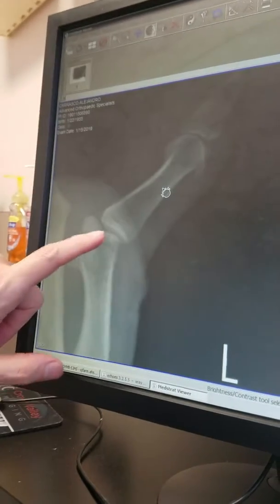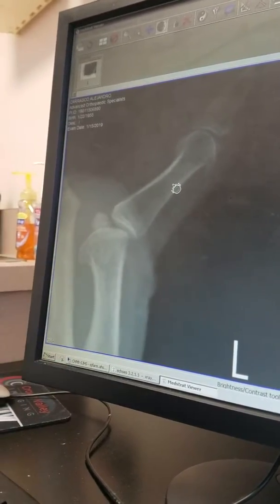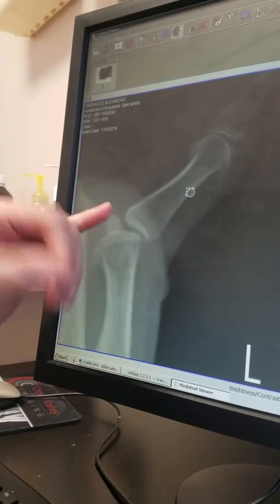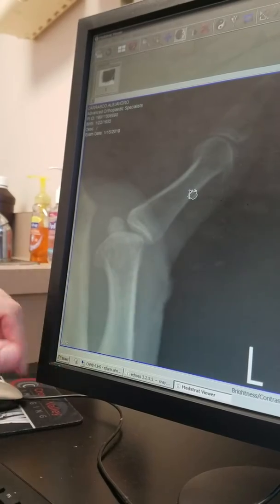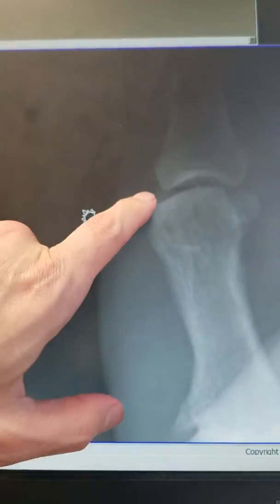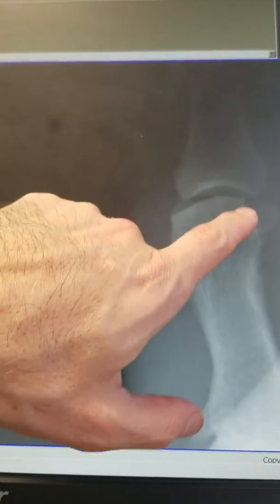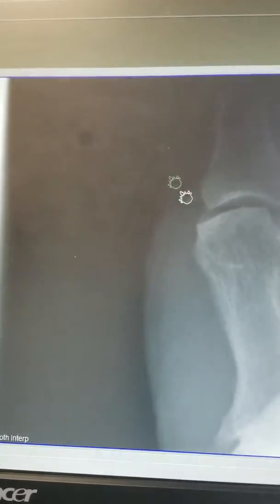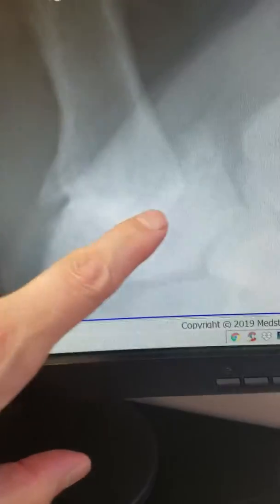The middle joint where you're hyperextending might be arthritic. It's hard to say by this X-ray. The bone surface looks okay. There's enough gap in here. And certainly, I want to look at this view over here. It looks perfect. It looks like there's no loss of joint space. There's a nice gap in there which is full of cartilage. That's good. Unlike this joint here, down here, which is completely gone.